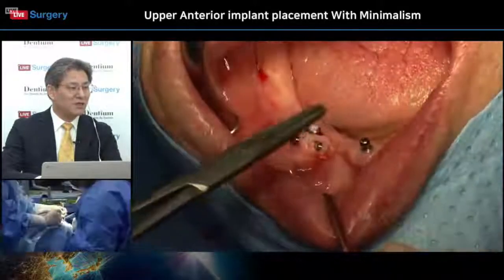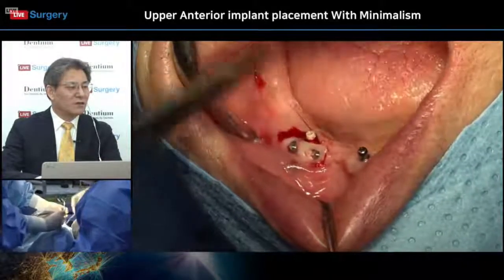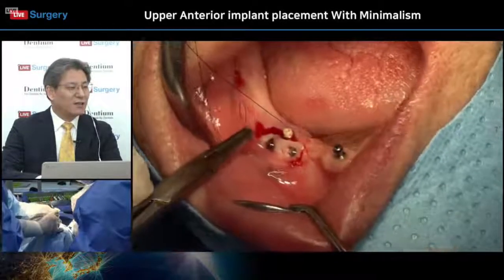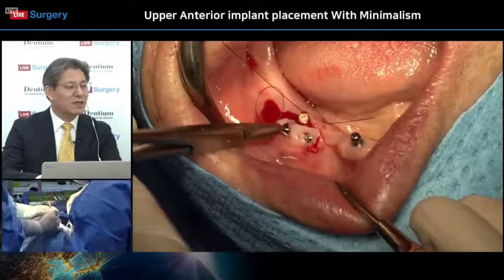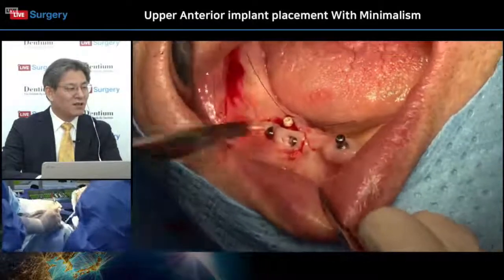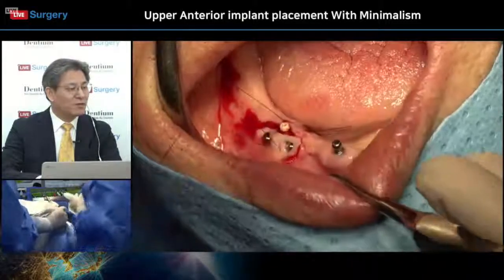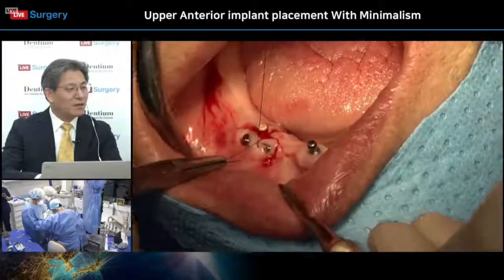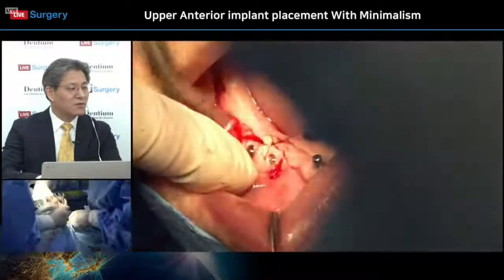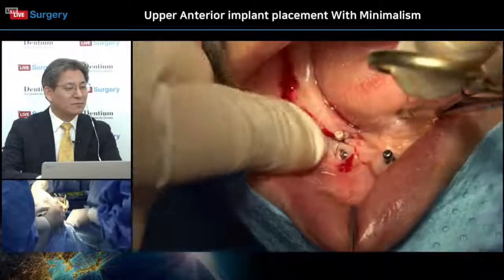Then after that, actually, this pin is very useful with the apically positioned flap. For example, if we want to have an apically positioned flap, there are many considering factors, sutures and flap positions and the location. But as you can see, the pin is working with an apically positioned flap-like effect. So if you want to have an apically positioned flap, make a flap, position it apically and use pin fixation. That's it. So simple procedure and useful. So I love this pin technique also.